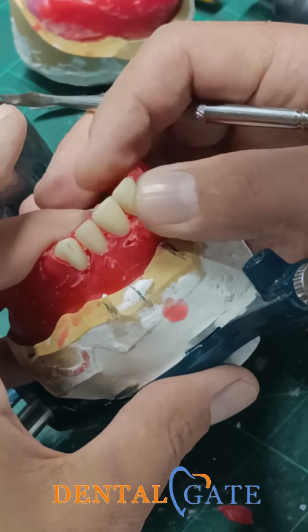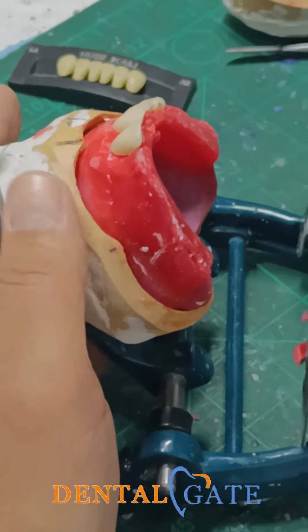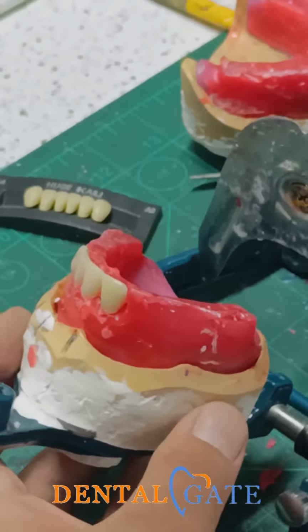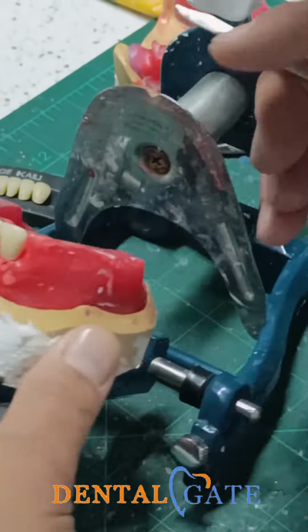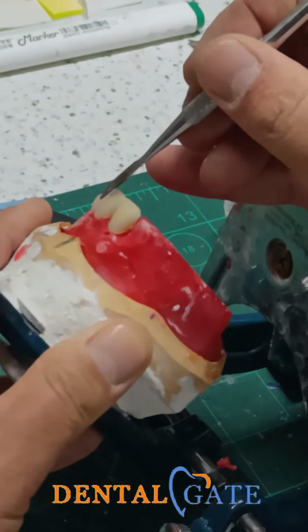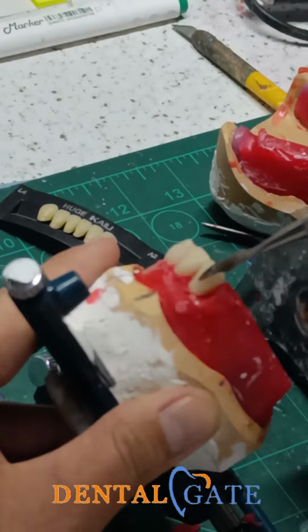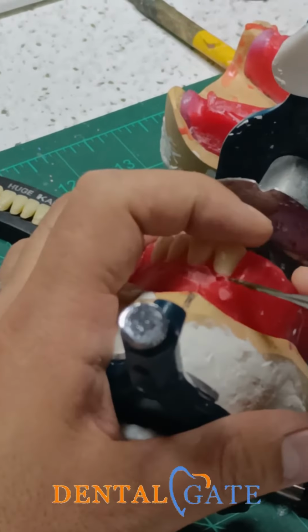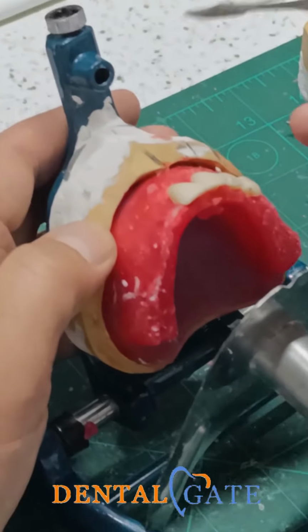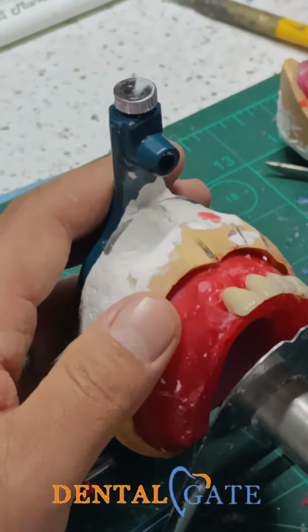So preserve the midline and double check from all aspects, from a bird's eye view, from the top, from the proximal, to be sure the curve starts within the same criteria. You can see this is the curvature, it will be prominent here, so I will make it as on the other side. And we'll check the midline, so don't make the teeth without contact.